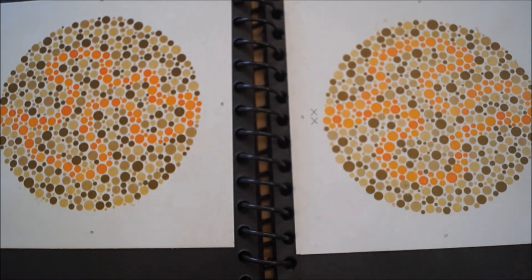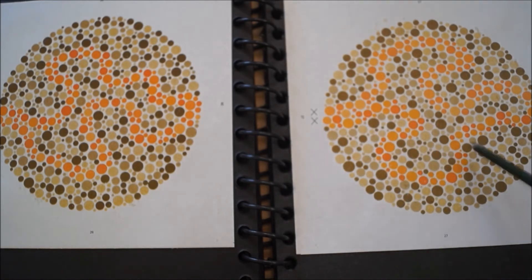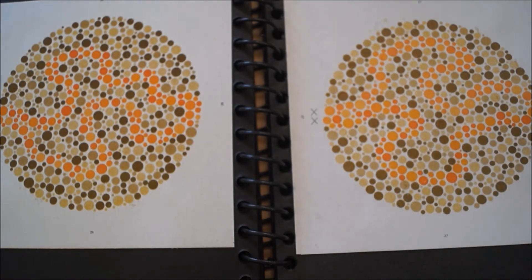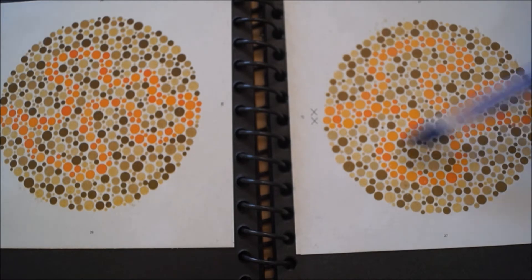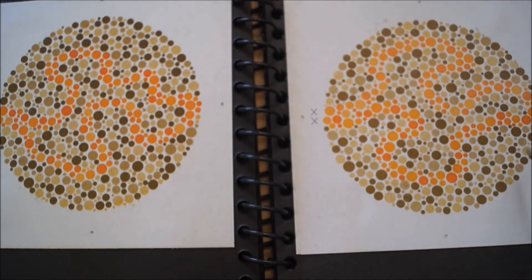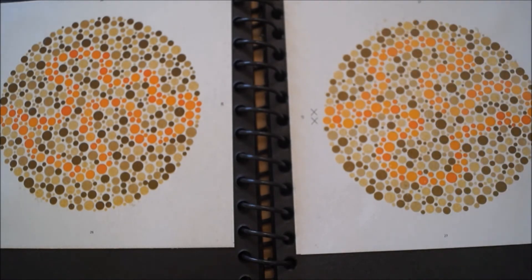Moving on to the next page. There are two lines and the patient was seeing both lines equally clearly. This one is more clear — this is completely clear, but brighter.